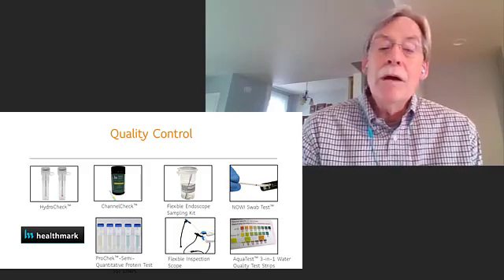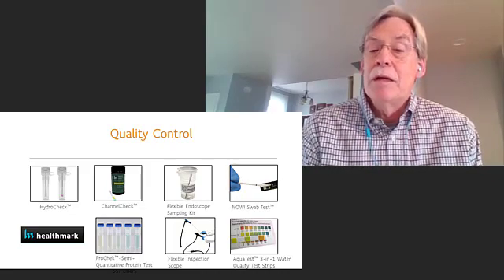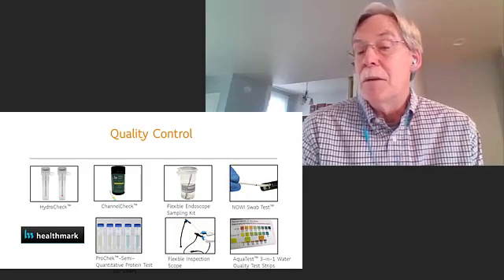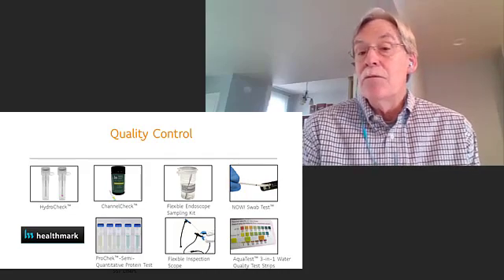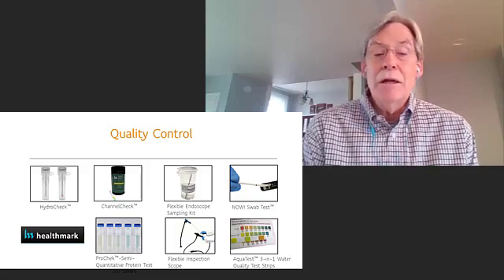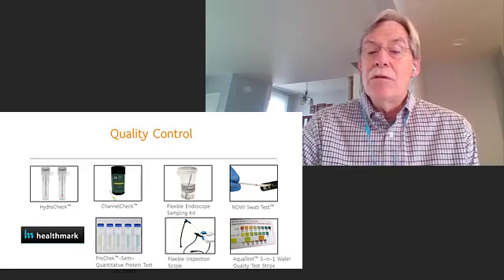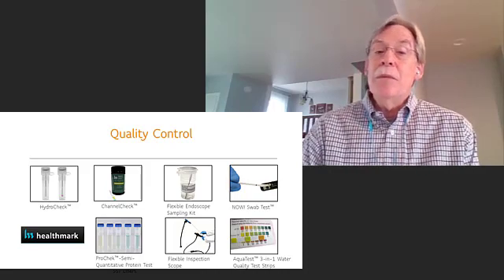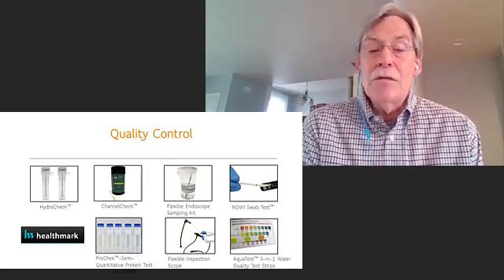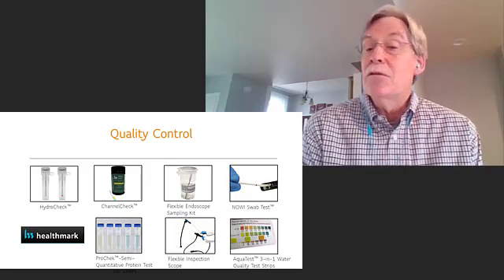Finally, on the lower right, you see the Aqua Test. It's a 3-in-1 water quality test strip. It's used to test water used in the cleaning processes. Results are available very quickly, within 30 seconds, for pH, alkalinity, and hardness. As we said, these represent several options for quality control to inspect and verify the cleaning processes. With quality control in mind, I once again turn it over to Seth for wrap-up.